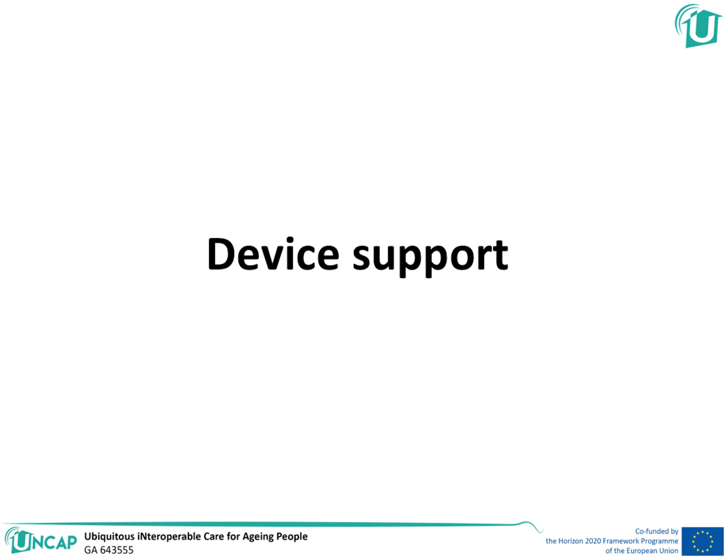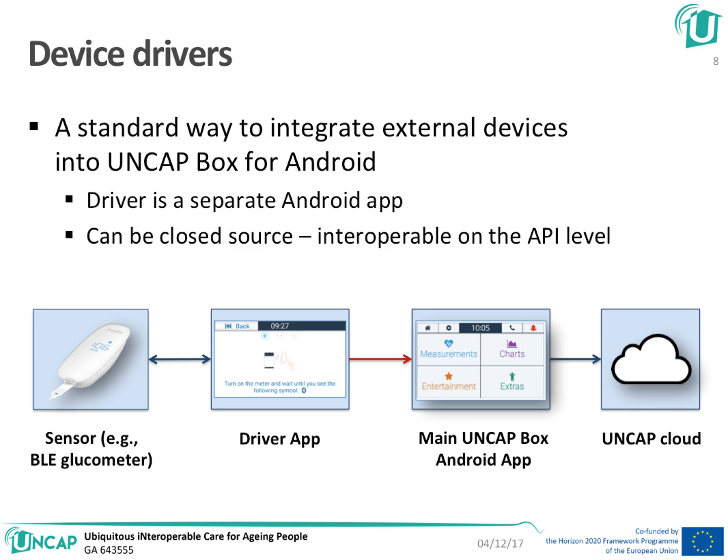Now, regarding device support, devices are an important addition for capturing medical parameters. And we've defined here in UNCAP a standard way to integrate external devices into the main application, and we call that driver. Now, driver is a separate Android application. It can be closed source, which means it's interoperable on the API level and can be provided by the device vendor.